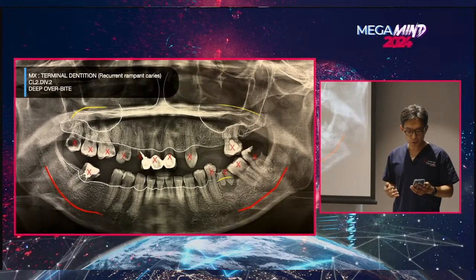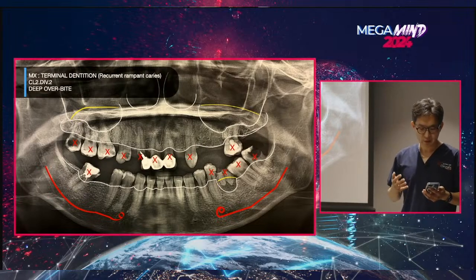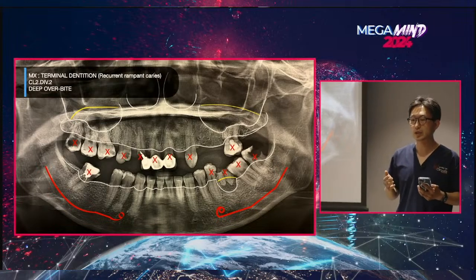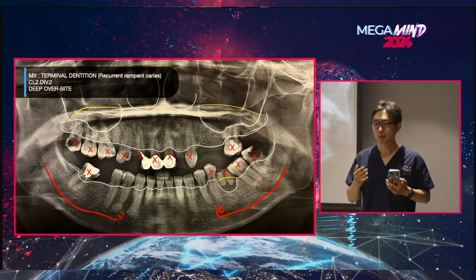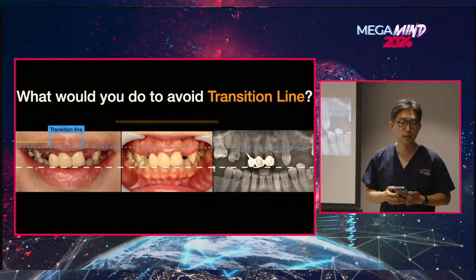So our treatment plan was to replace posterior teeth in the lower with implants to create better function and improve her occlusal plane. And for the maxilla, we decided to do fixed full arch implant treatment to replace compromised teeth and give her better aesthetics.